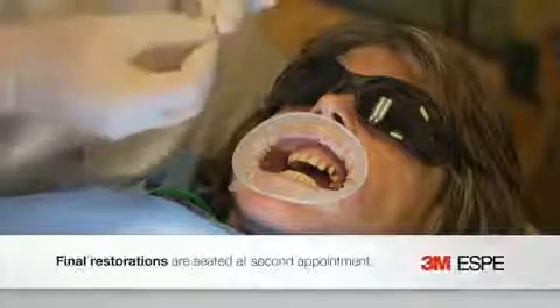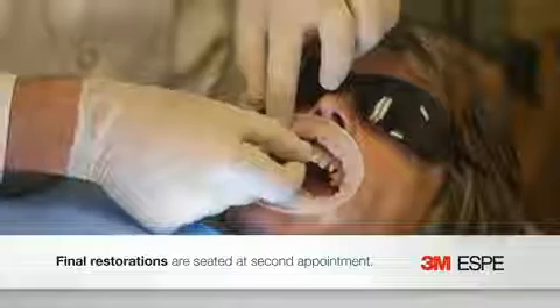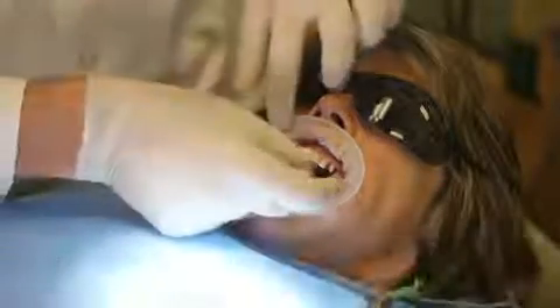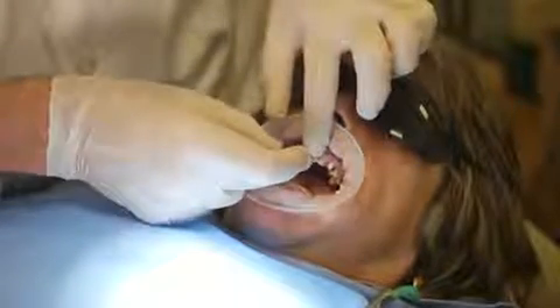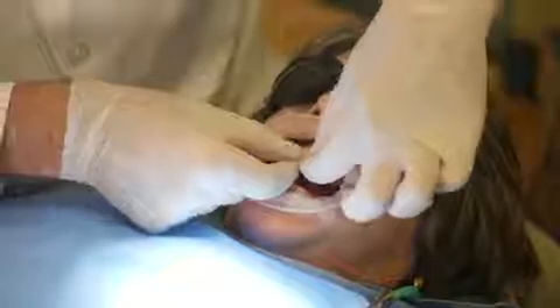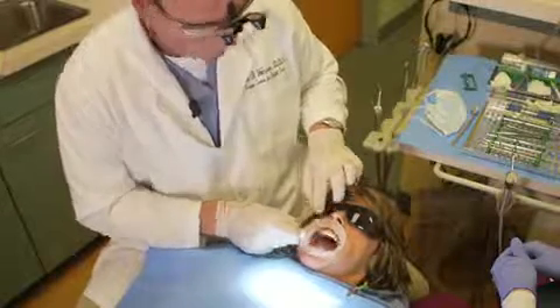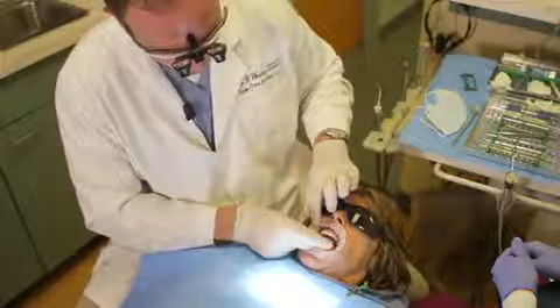We'll start in the center and work our way around. These are just straight off the SLA model, straight into the mouth. We do a dry try-in so we can make sure that we have good marginal fit. Very typical for my digitally scanned cases, the restorations fit really precisely with minimal adjustment, if any at all.